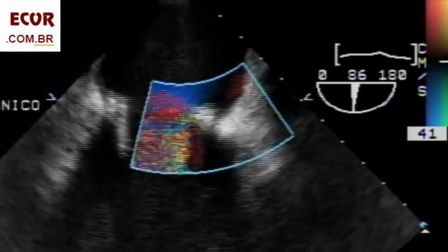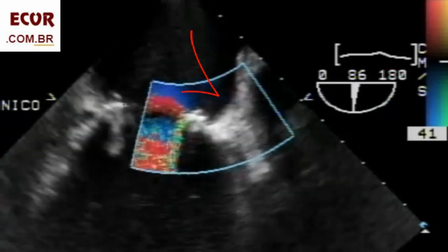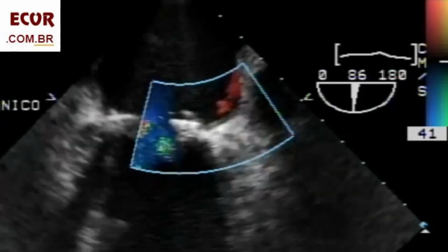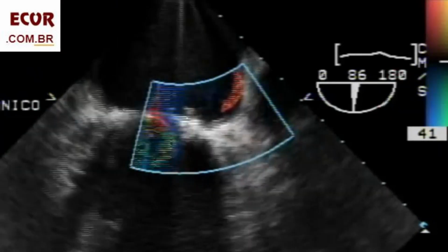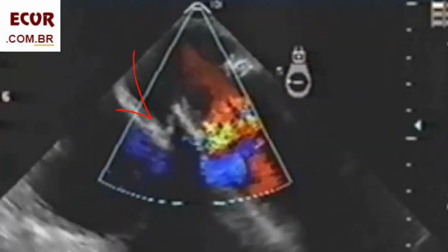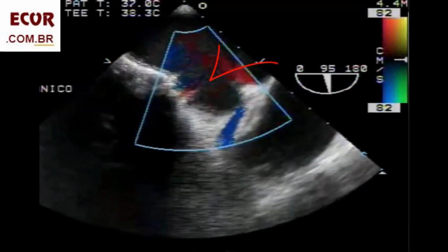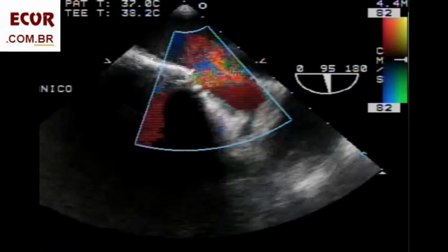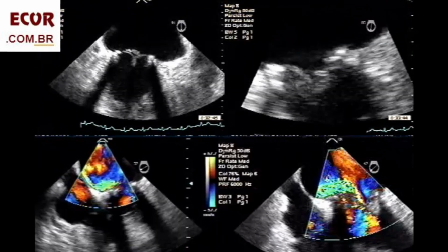Intraoperative TEE, in another case. Look at this small paravalvular leak right after implantation, yet in the operating room. We may find these tiny leaks that disappear later on. It is not necessary to return to circulatory bypass to fix this. Another small paravalvular leak. Now, with a paravalvular leak like this, it is severe enough to return to circulatory bypass for fixing. TEE of a mitral bioprosthesis with a clear rupture of one leaflet.